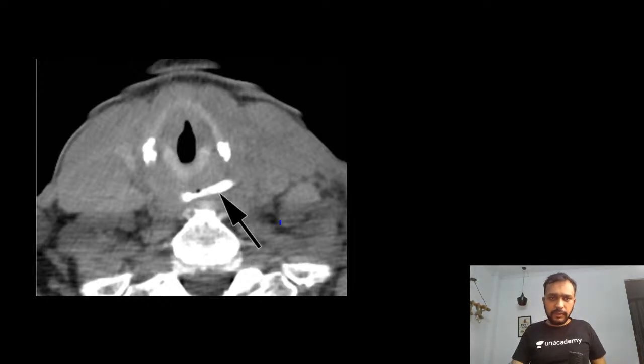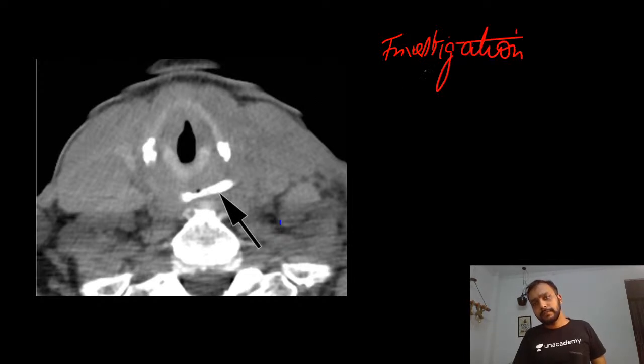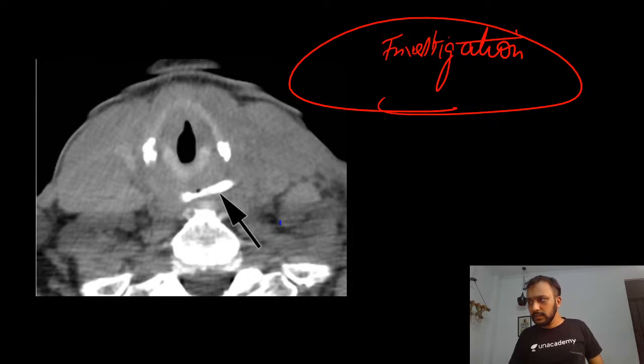Anyone, guys, tell me what the investigation is that is being shown to you. Very good. This is the NCCT image. Which part is being shown to you?